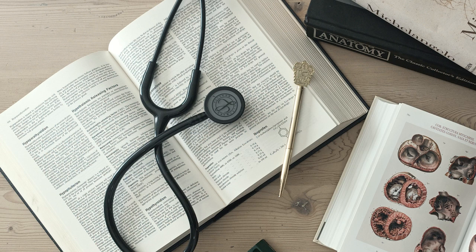Got it. Next, we have the dominant QRS complex, which is the big one that jumps out at you. What's happening electrically there? The QRS complex represents ventricular depolarization. Now, here's a key insight and a common point of confusion. The large electrical deflections that produce this complex only occur during the early phase of ventricular depolarization.